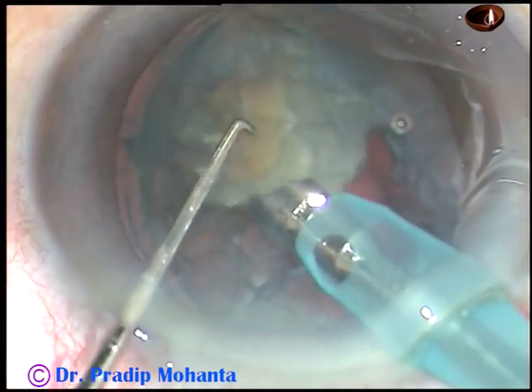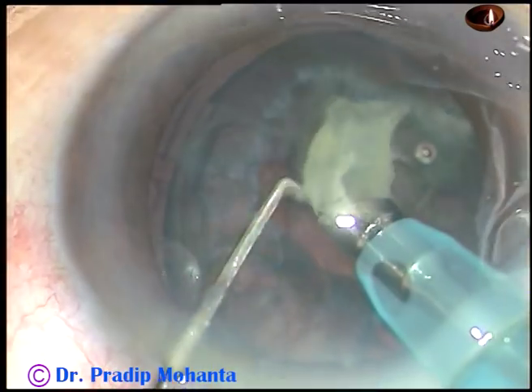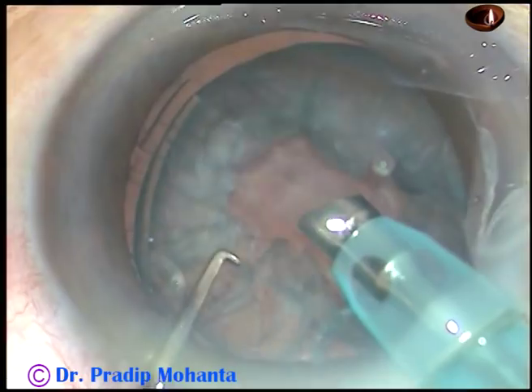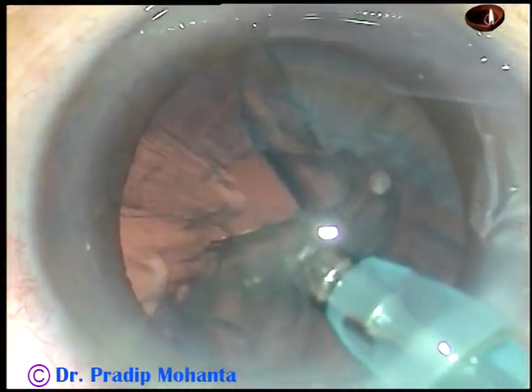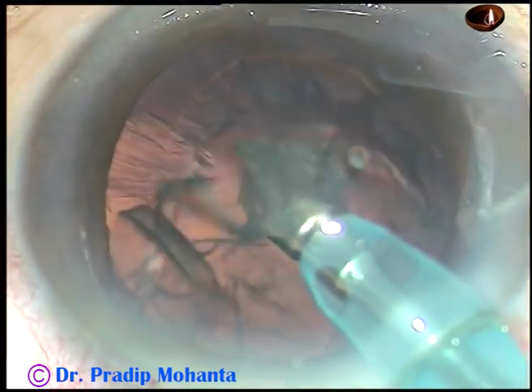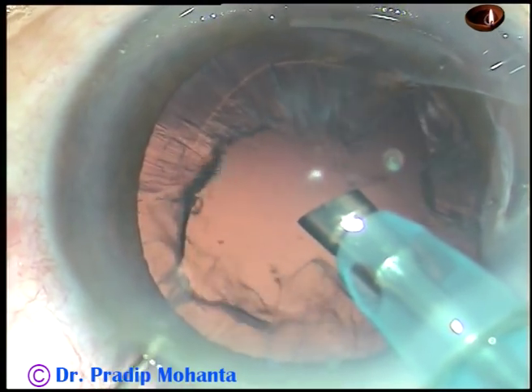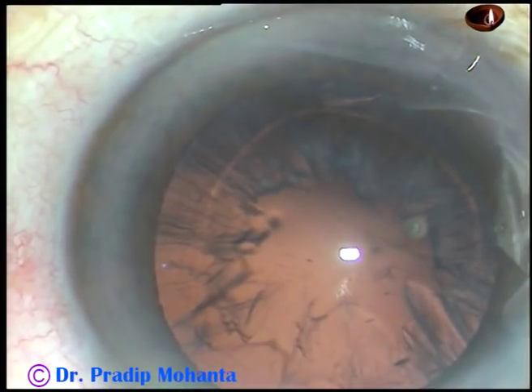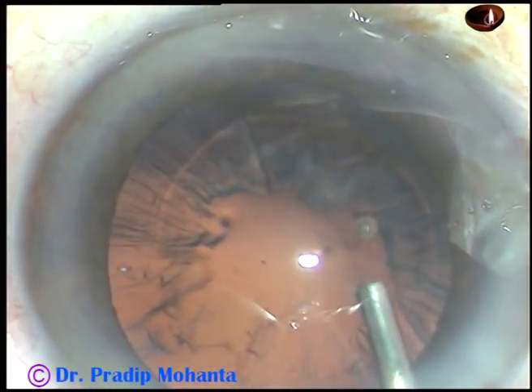The care that I am taking is that I am working in the anterior part of the capsular bag, not in the anterior chamber, because the anterior chamber is very shallow. The nucleus has been managed. Now this is the epinucleus — I pull the epinuclear mass to the center, apply very minimal ultrasonic energy, emulsify it, and remove it. The nucleus and epinucleus have been nicely managed.